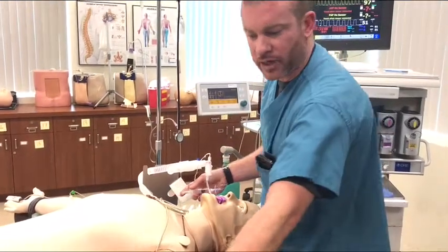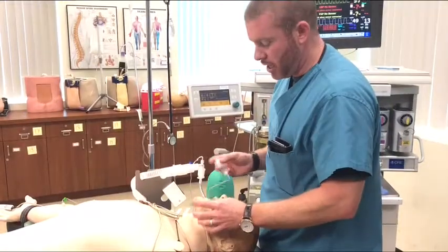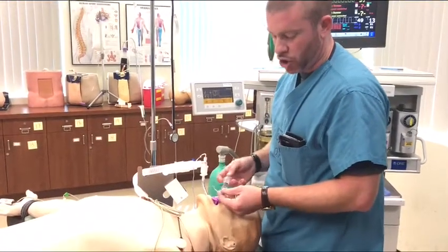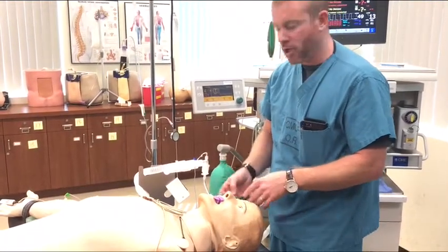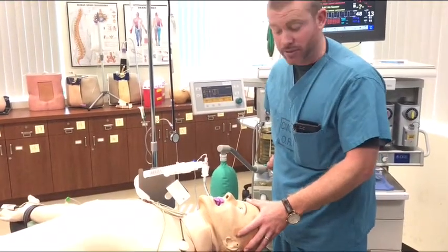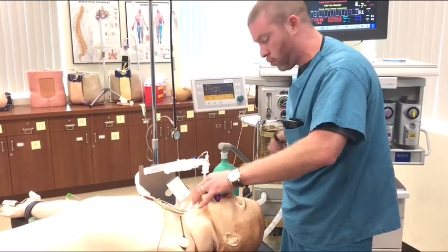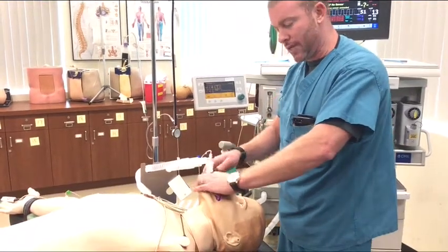After I've done that, I come over here 2 or 3 minutes. I check. He has sustained tetany, 4 out of 4 sustained tetany at 100. I then have that tape off. I then have this hooked up onto the pilot cuff. So the next thing I can do is say, Carlos, wake up. And as soon as he opens his eyes, can you lift your head up? He lifts his head up for 5 seconds. I immediately turn this up to 20. I deflate this all the way down.